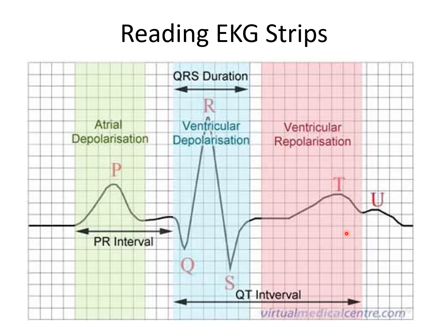So remember, if the conduction time is taking a long time, then we're dealing with the horizontal axis, so this would be all spread out. In fact, if it's taking longer for that electrical impulse to travel through the ventricles, for example, a patient that has heart failure, then we would expect this QRS complex to be much wider. Okay, so hopefully you can envision that as we go forward.